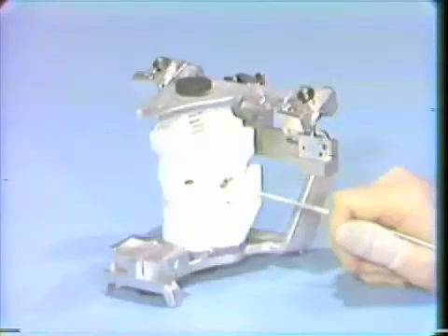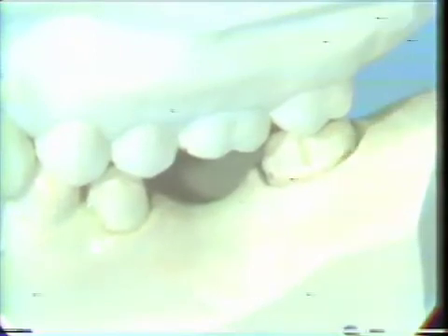We have now prepared our bicuspid and our molar teeth, and prior to taking our functionally generated registration, we would like to establish an interocclusal registration so that we may articulate our anatomic and functionally generated core as we proceed through the technique.